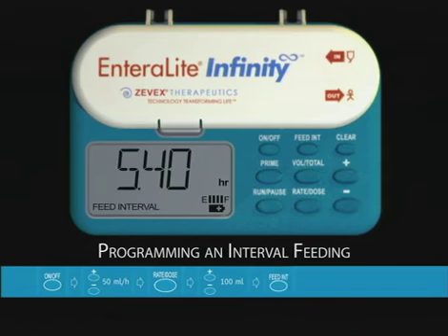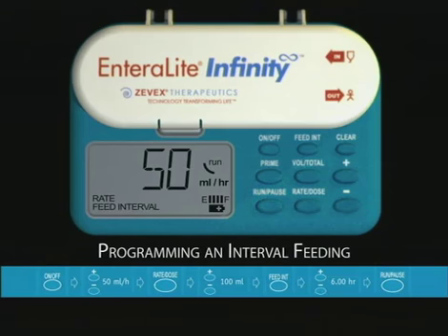Press the feed interval key to display the feed interval setting. Press the plus or minus key until 6 hours is displayed. Press the run pause key to start the pump. The display will show the set rate, the arcs around the run symbol will rotate, and the display will show feed interval.